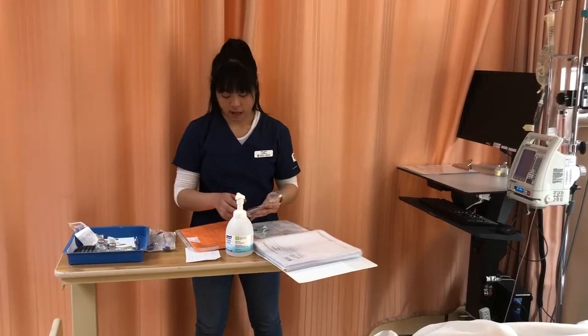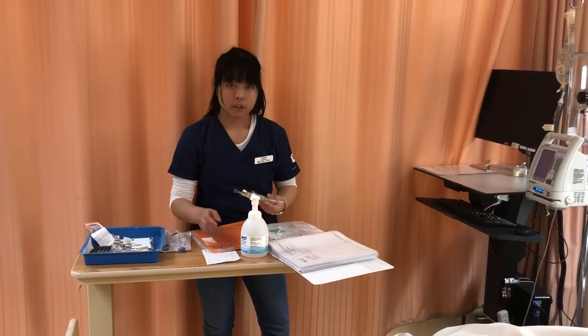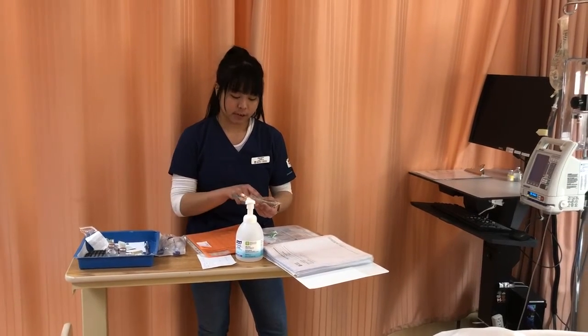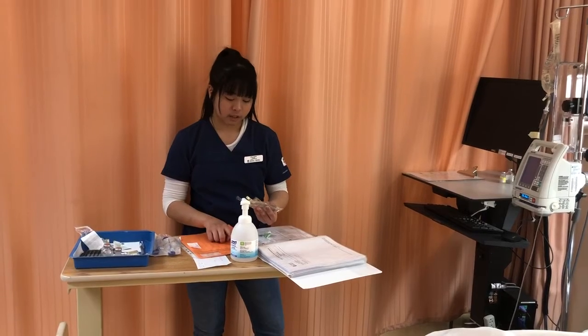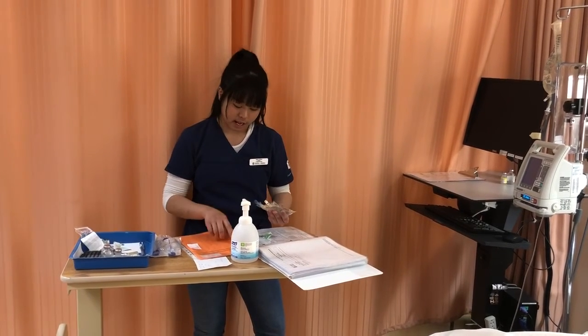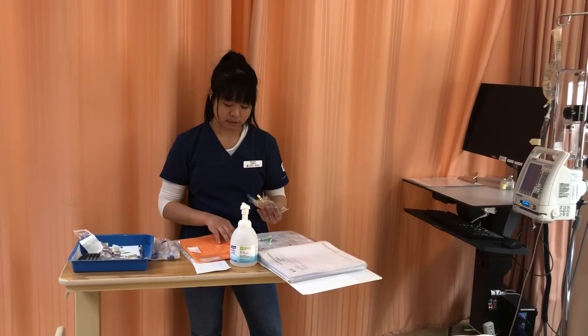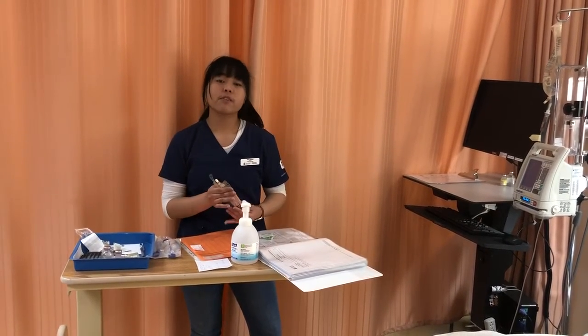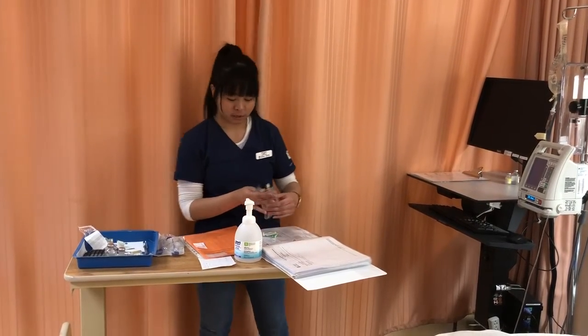Okay, so I have my Piggyback here. So I have confirmed the right patient, Frida Fritz, and it is Penicillin G Sodium. It's 3 million units, right dose, and it's to be given IV, so that's the right dose, right route. It's to be given every 4 hours. It's the right time and frequency, so we're good with that.